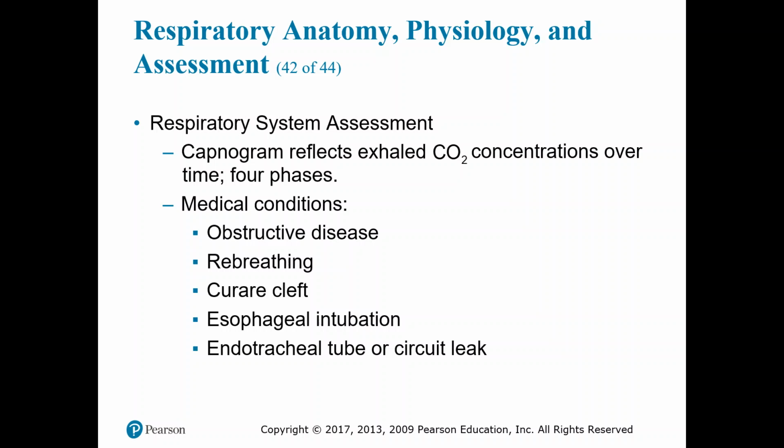And then you start your downswing, which is phase 4, and that's the inspiratory phase. It's the sudden downstroke and ultimately returns to the baseline during inspiration. That's where the respiratory pause restarts the cycle. And then you get back down to your baseline, restarting at phase 1, and that is 1 cycle of the respiratory phase.